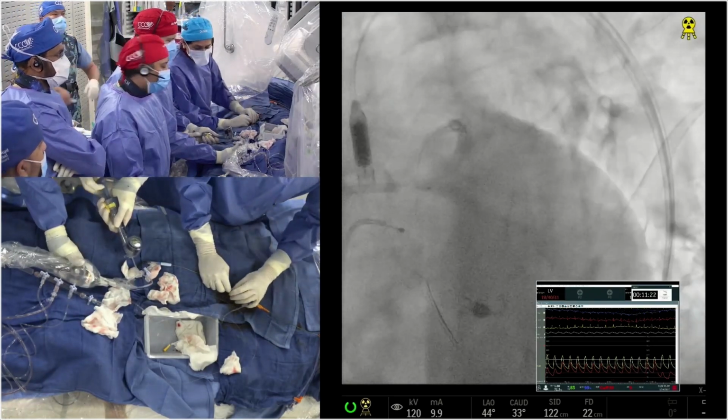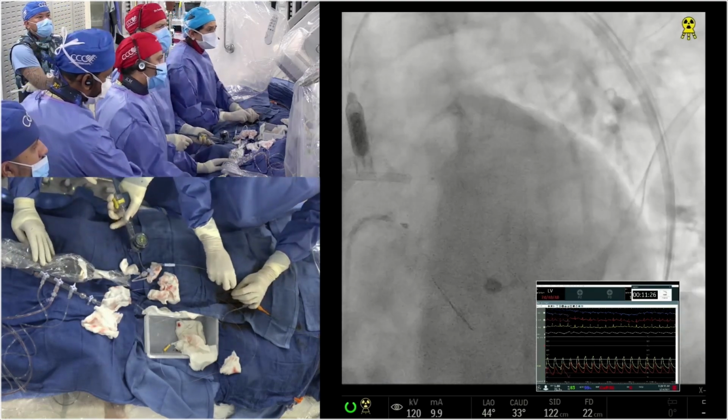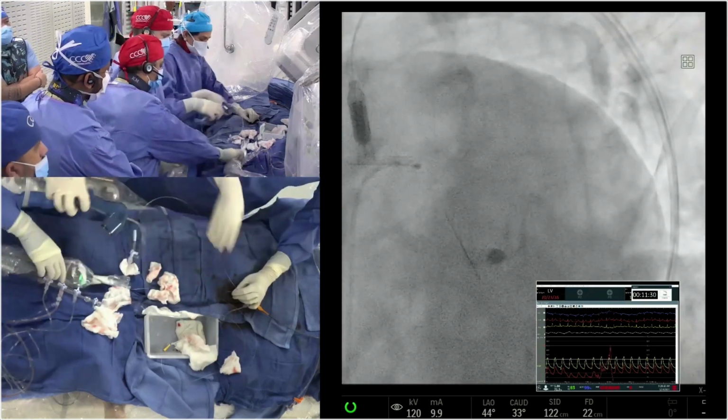Yeah, no, this is amazing. I want to be done. I think I'm done. These patients have very poor reserve, really. So I guess this one would be. I'm glad you have an Impella device there.